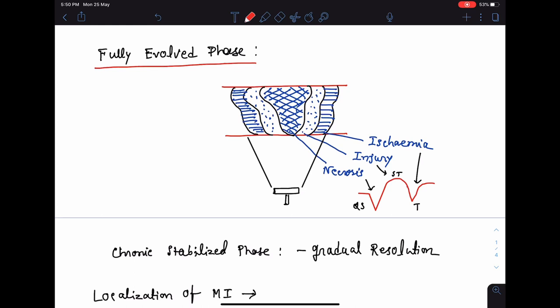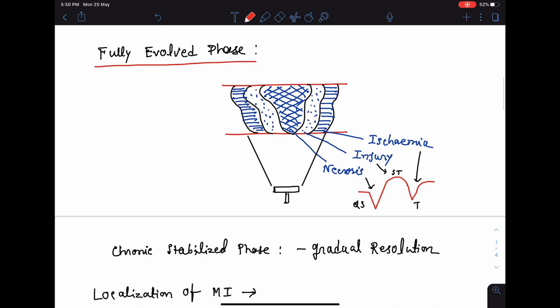Clinically, most of the ECGs we see are in the fully evolved phase. The infarcted zone consists of a central core of necrosis, which is surrounded by an area of injury, and injury is surrounded by an area of ischemia. If a lead is placed towards the infarcted zone, it will recognize the necrosis as a deep QS wave.